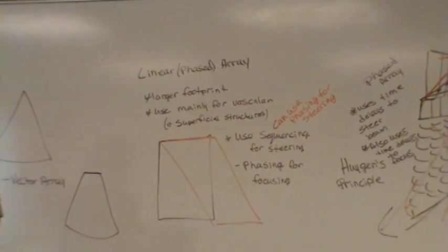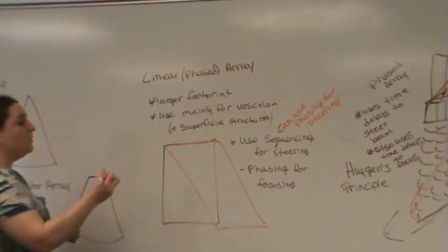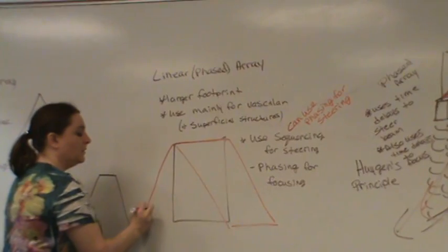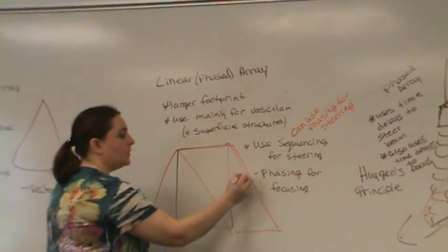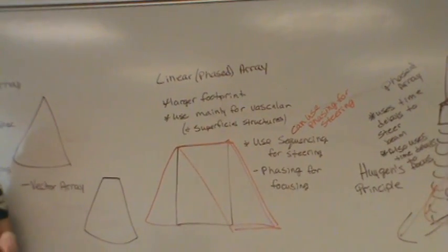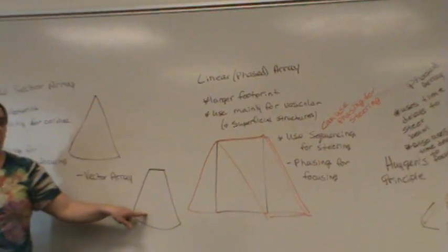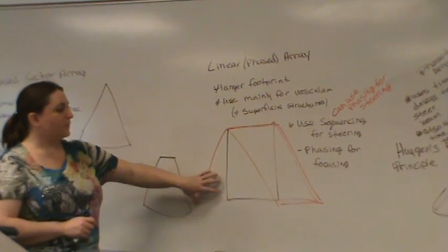The other way that it uses steering to create our images: if you notice on some systems, these linear images have wings on the side, which is kind of this idea, this vector thing. So we use phasing for this wing out here.